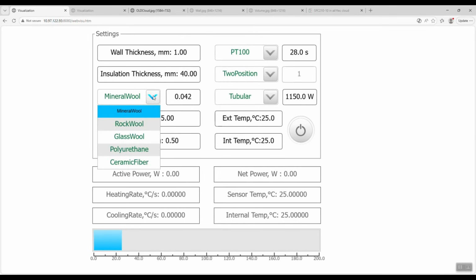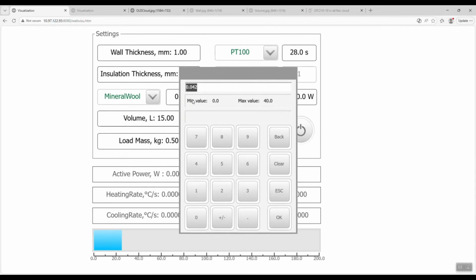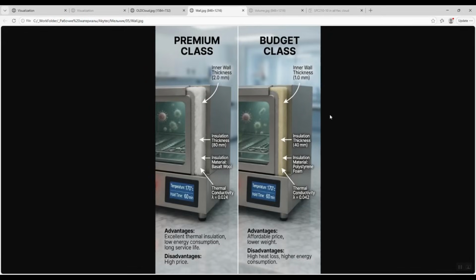We can choose, for example, rock wool, which is a type of mineral wool, basalt wool, fiberglass, polyurethane foam, or ceramic fiber. For each type, we can set the thermal conductivity coefficient of the insulation material. The higher this coefficient, the faster the sterilizer chamber loses heat. Let's see how these parameters affect the process.